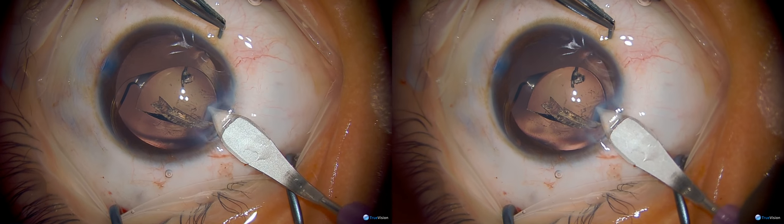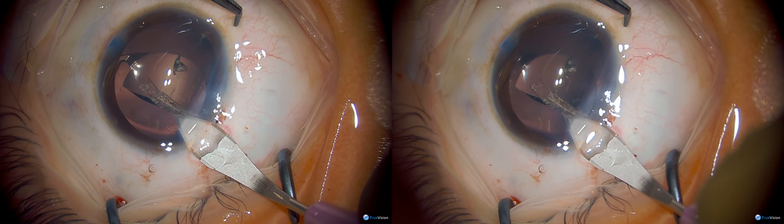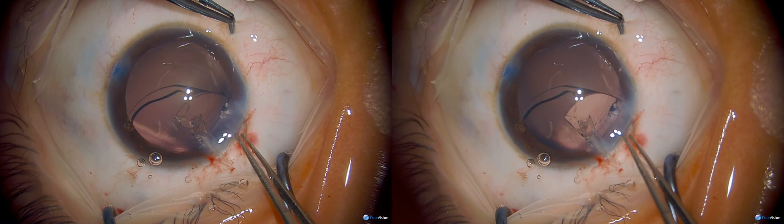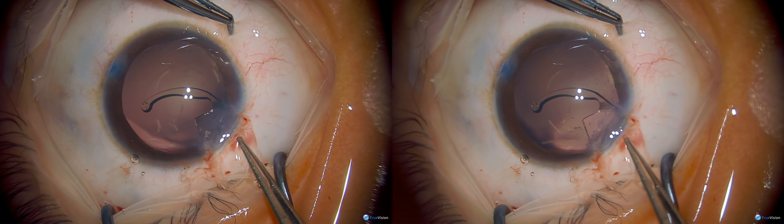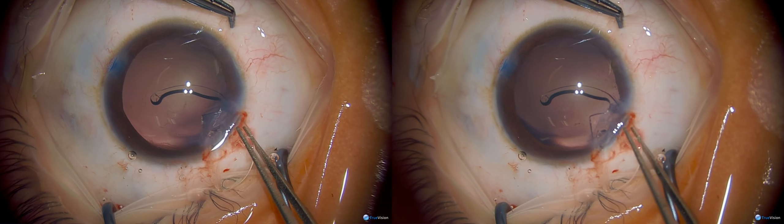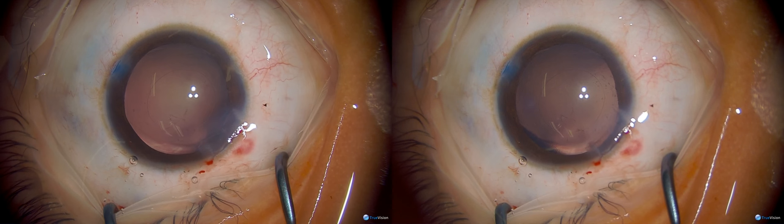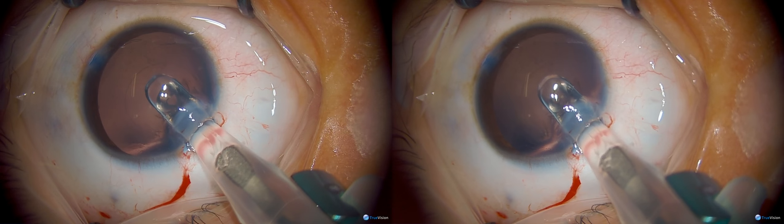The halves are a little bit unequal, so the wound is being enlarged slightly to allow a less traumatic explantation of the larger jagged piece — you don't want to be dragging this across the endothelium of the cornea. There's also a technique of only cutting partially across the IOL and then cartwheeling the two halves out while they remain attached; you just have to be careful not to contact the endothelium when you do that.